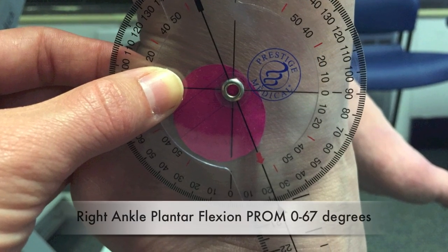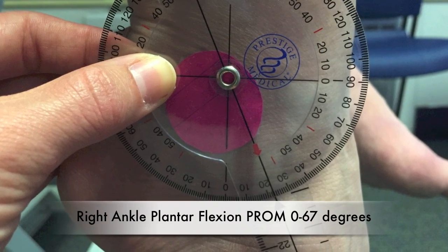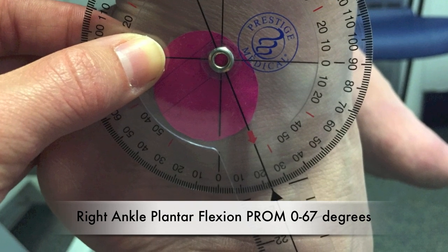Right ankle plantar flexion passive range of motion: 0 to 67 degrees.